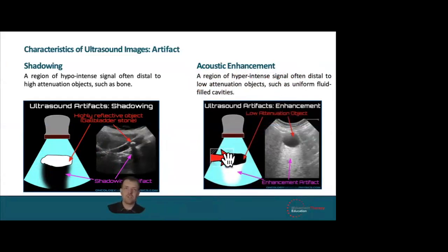And this is usually found with fluid. So if you have swelling of something and you scan it and there's this black blob like that, it's fluid, because ultrasound passes through fluid really easily. Hence using ultrasound gel, it will make whatever's behind it really bright. So this is really useful, especially when scanning around feet.